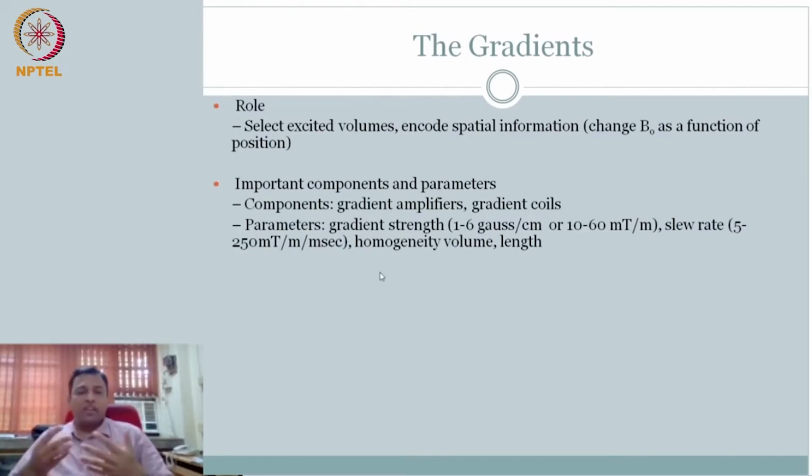Parameters are also very straightforward, though the jargon is slightly specific to this. What is a gradient? We know this from mathematics: it is just change. When we talk about anything that is changing, we are interested in the slope. Slope tells us how fast or how slow it changes, so a gradient has to do with rate of change.